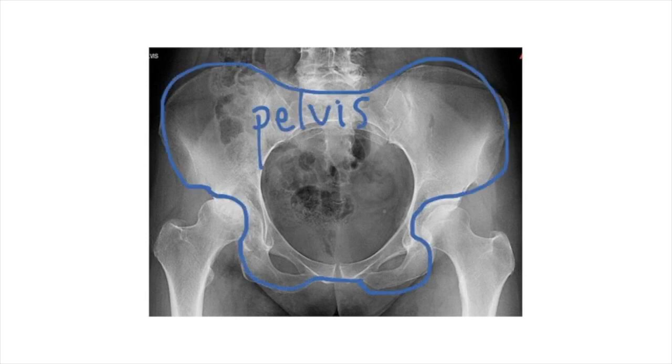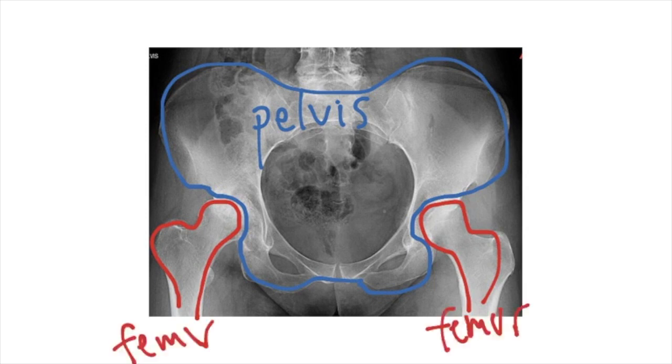Just to provide some quick orientation: this is the pelvis bone, and these are the two femur bones, which are your thigh bones. The hip is where the pelvis and the femur meet up. At the top of the screen you can see a head, a spine, and some little arms coming off.